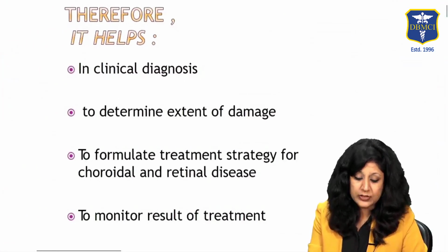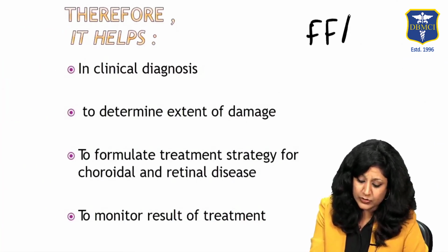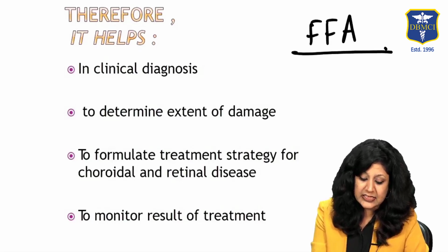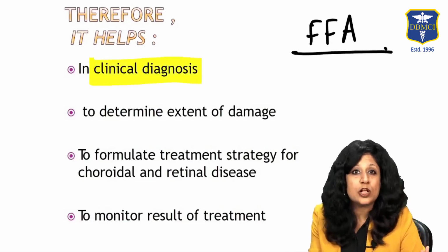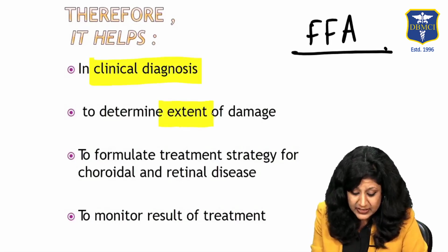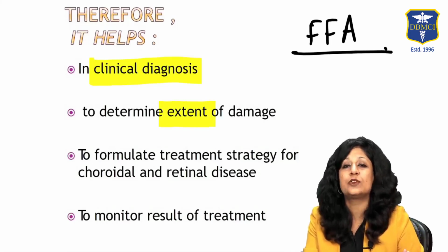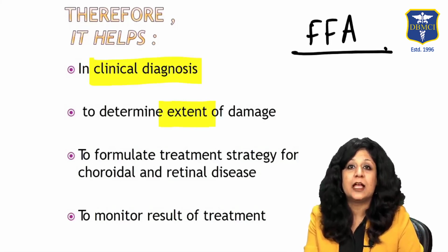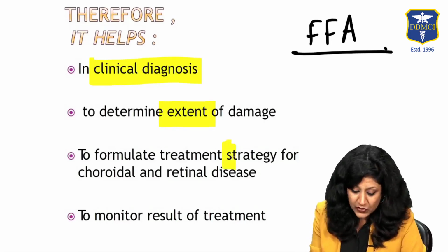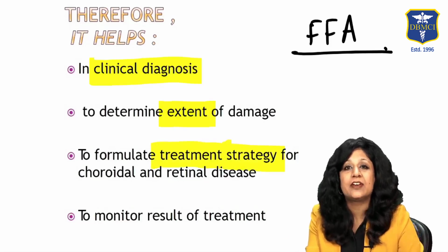So how will FFA help me? It helps me in making the clinical diagnosis, right? It also helps me find the extent of damage. Not only am I getting a diagnosis, I am also getting how much severity is there. Number three, what should be the strategy for the treatment? How should you start treating it?